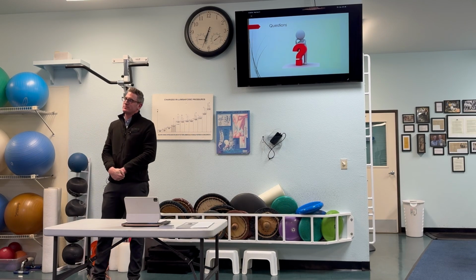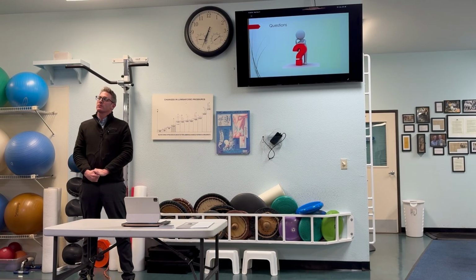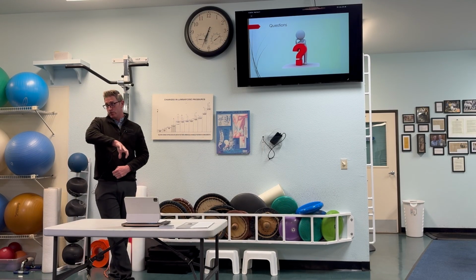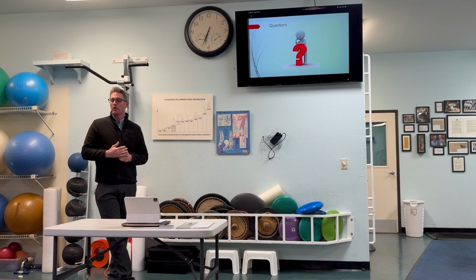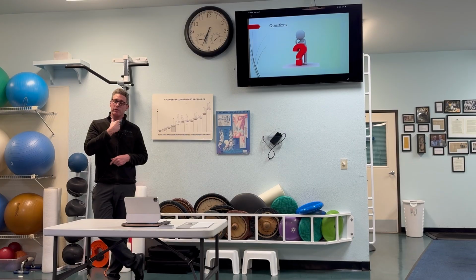Could you talk about similarities and differences between a lumbar disc versus what's used in the cervical spine? Are they the same? Pretty similar. I think one difference is that there's only one implant for the lumbar spine currently. So there's only really one implant that can be chosen, although the data on that is pretty strong. Whereas with the cervical spine, I think there's 3 to 4 currently. The same manufacturer that makes the lumbar implant also makes a variety of implants for the cervical spine. There's one other that's probably the most common, called Mobi-C, but similar in a sense.